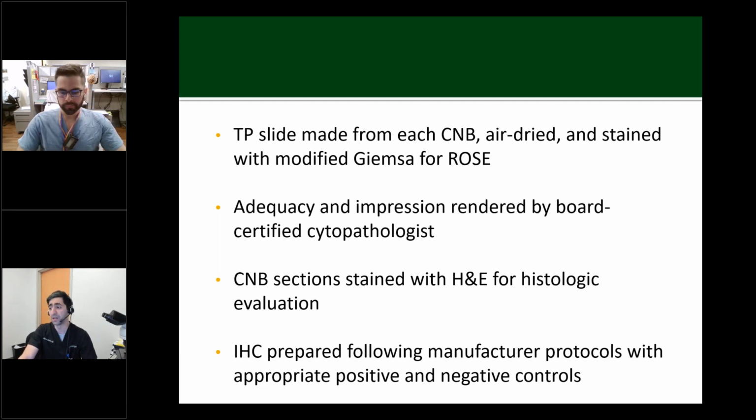Subsequently, the touch prep slides were prepared from each core needle biopsy, air dried and stained with the modified Giemsa Diff-Quik for ROSE evaluation. The evaluation was conducted by a board certified cytopathologist who assessed the adequacy of the specimen and provided the on-site impressions when necessary. Following the ROSE procedure, the core needle biopsy specimens were placed in formalin and embedded for histologic evaluations.